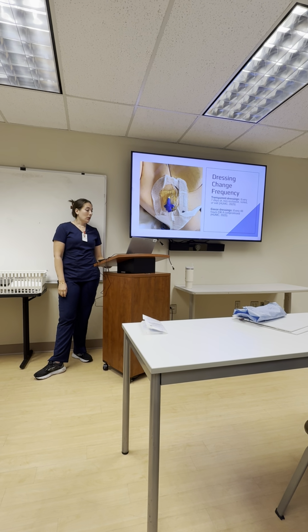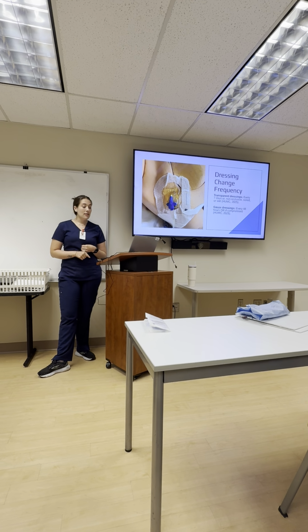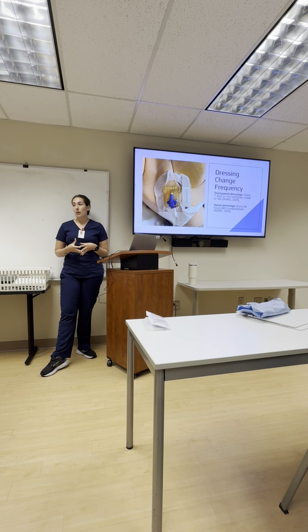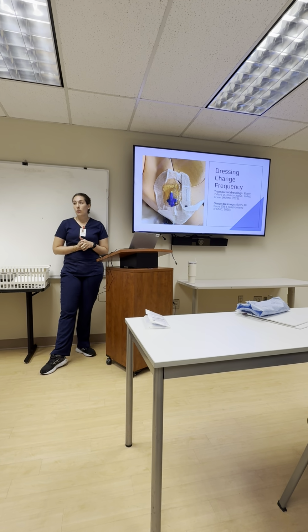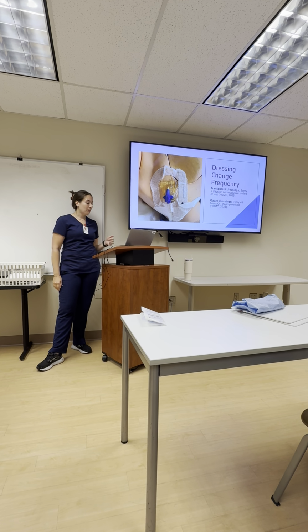So here at Hackensack, you're going to be changing a transparent dressing with CHG every 7 days, or sooner if it's non-occlusive, soiled, or wet. So if you assess that the dressing is compromised, you immediately want to change it. If you have a patient that has a gauze dressing, you want to change it every 48 hours. If it's saturated or compromised, we want to change that a lot quicker.